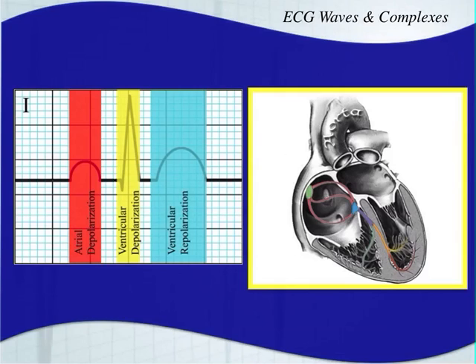Well, how does that show up on an EKG? The P wave, that first positive deflection, comes from atrial depolarization. That's where we get our P wave from. When the atria depolarize, the atria contract in response to the electricity. That depolarization wave is the P wave.